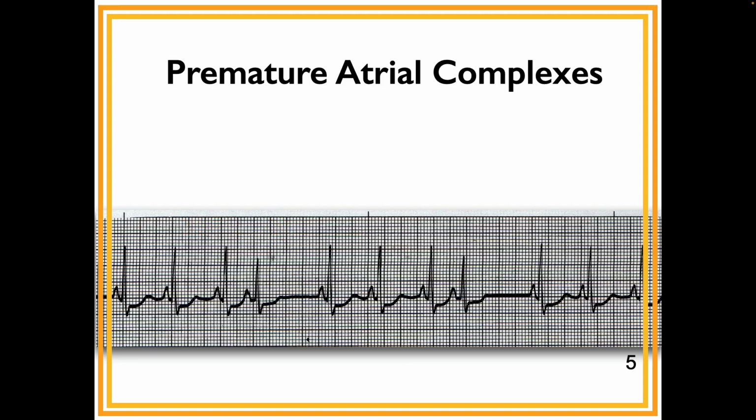Who's got the pointer? Okay, you want to point to the PAC? Or there are two of them actually. Yeah, now notice the characteristics. This is the one we saw with a slightly less amplitude. But notice there's a P wave in front of it.